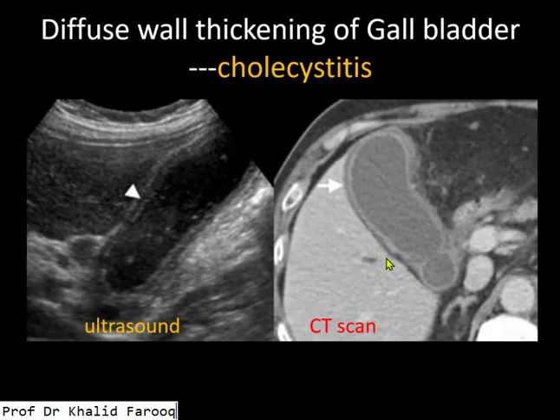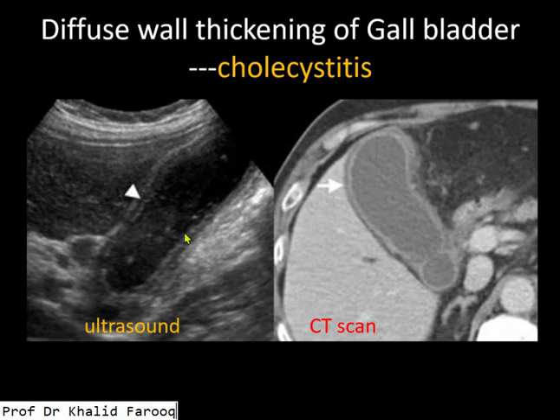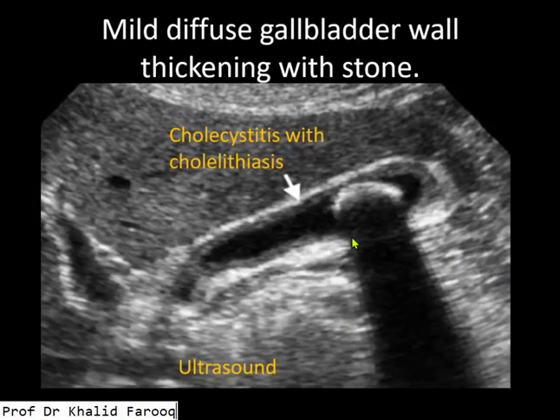Here we have ultrasound and here we have CT scan. We can see that there is diffuse wall thickening on both ultrasound and CT scan, and here we have inflammatory changes in the pericholecystic space. So these two represent cholecystitis.